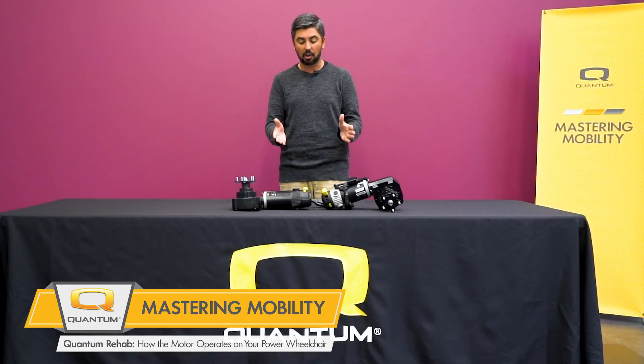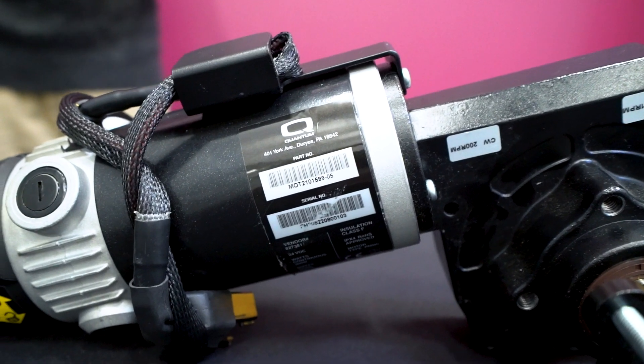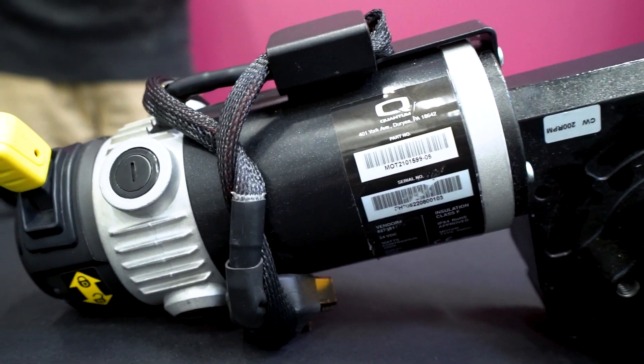The two major components of these PMDC motors are the stator and the armature. The stator is the outer part of the PMDC motor which makes up its housing.